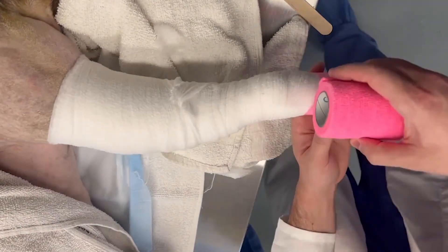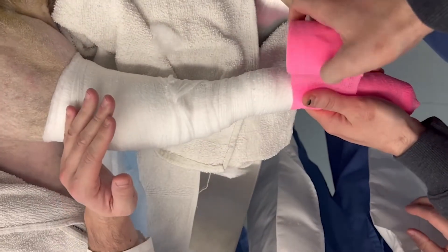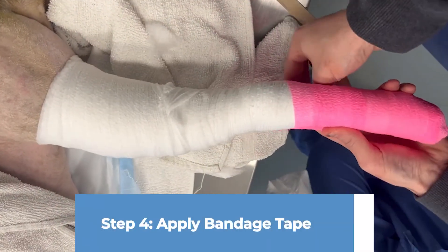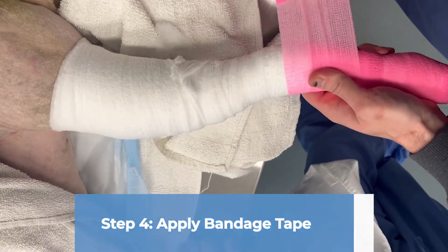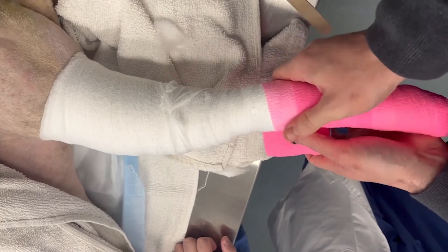The tertiary layer of a modified Robert Jones bandage is a self-adherent bandaging tape, which most of the time we use vet wrap. This layer can be applied too tightly, so it is important to maintain appropriate tension when placing it on the bandage.